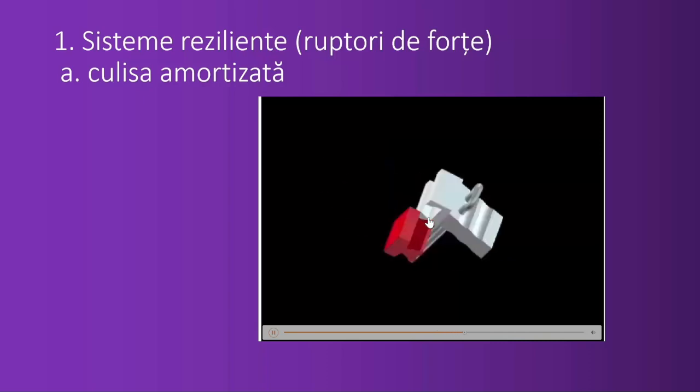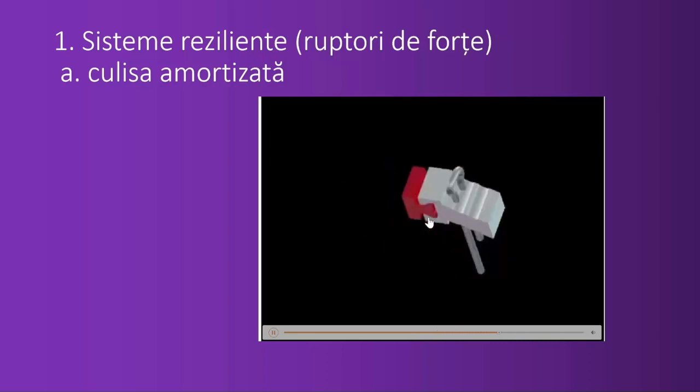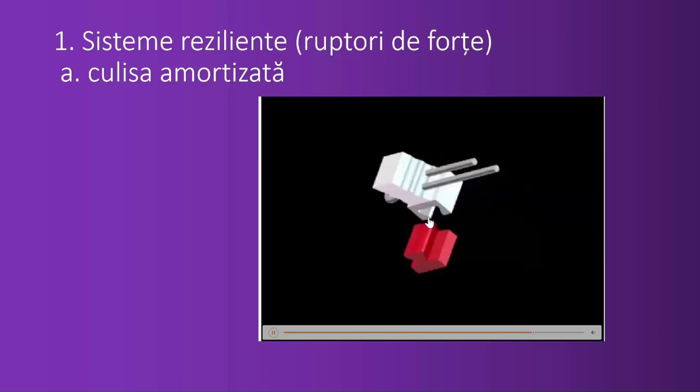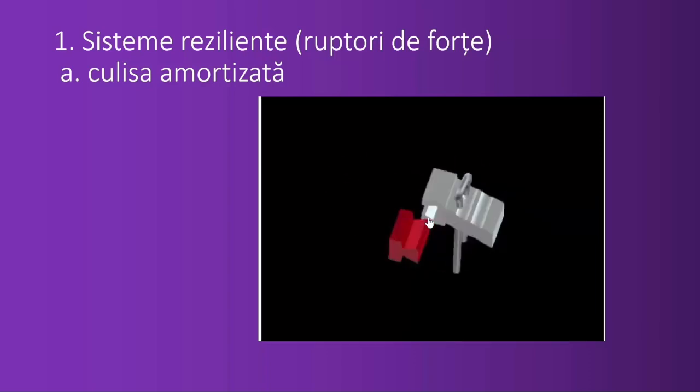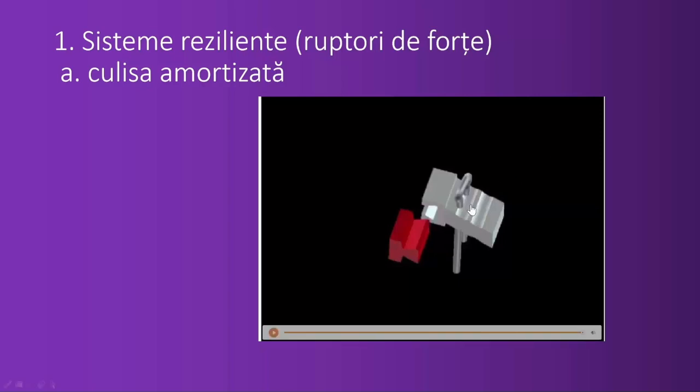So of course this allows a little bit of movement. The pin actually moves a little as the spring allows, and this type of attachment allows quite a bit of mobility. At the same time, it keeps the denture in the mouth, but allows it to sink into the gum.